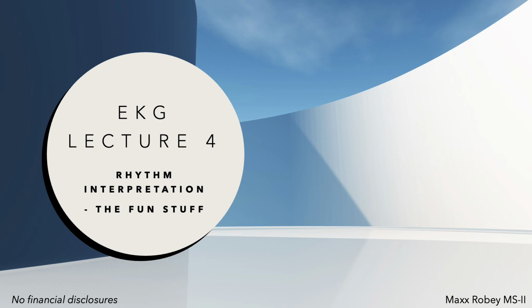Today we're going to talk about all things rhythm. This is the fun stuff, people. This is what Einthoven envisioned for us. Einthoven Envision sounds like a gnarly rock band.